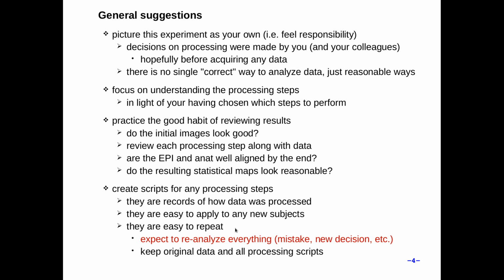They should be easy to repeat, and notably, you should expect to reanalyze all your subjects. You made a mistake in some choice. There's a new decision. For example, you've decided, well, actually, I don't want to blur in my single subject analysis because I'm going to use the ETAC option for 3dttest++ to basically deal with all the voxels and the multiple comparisons issue, and it'll do the clustering and it'll do multiple blurring levels, and so I no longer want to blur at the single subject level.